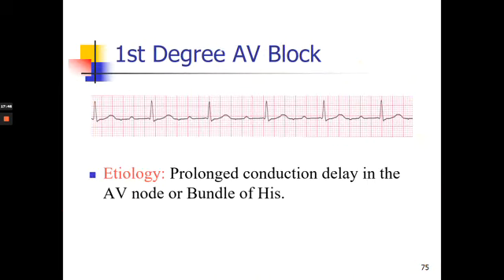This is P, Q, R, S, T, P, Q, R, S, T, and so on. Remember, this is the P here, from the beginning of P to the beginning of Q here.